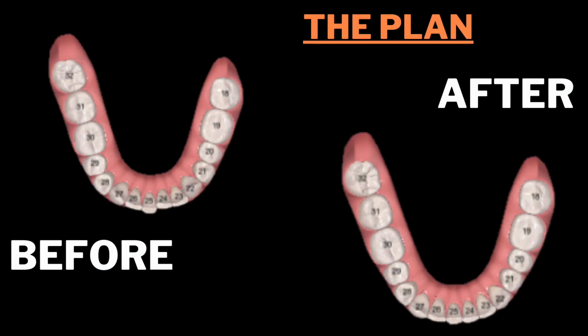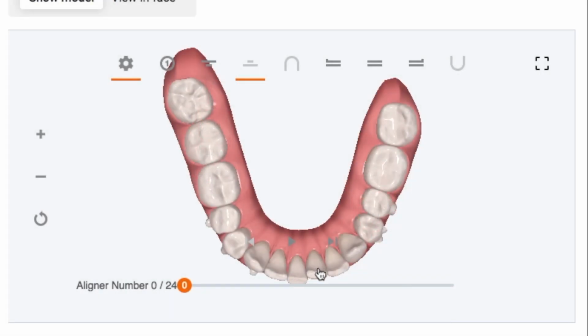So now let's look at the palate view of my lower teeth. Remember, it's like you were looking down at my teeth. Pretend there's a tongue in the middle, and that'll help if you can't quite visualize it. With the molars, notice that the third molar is so impacted and pushing so hard on the second molar that the second molar is twisting inward.